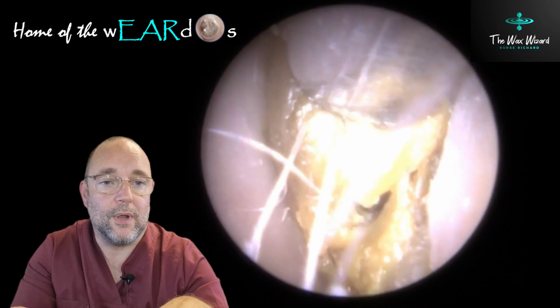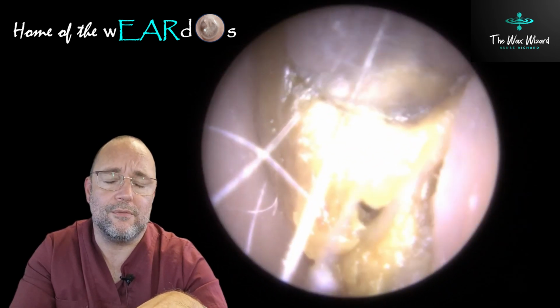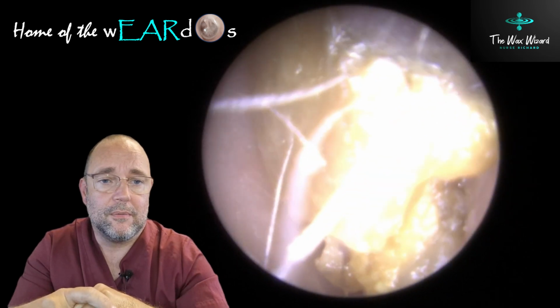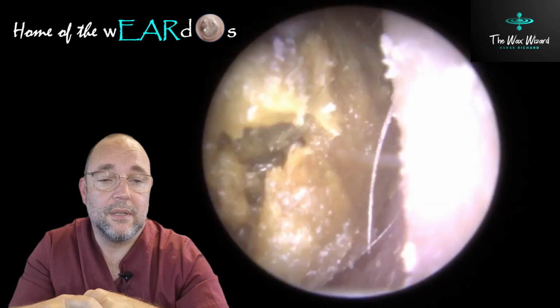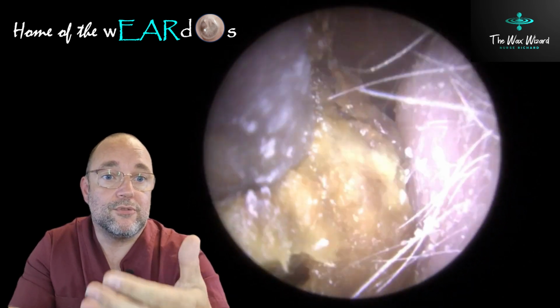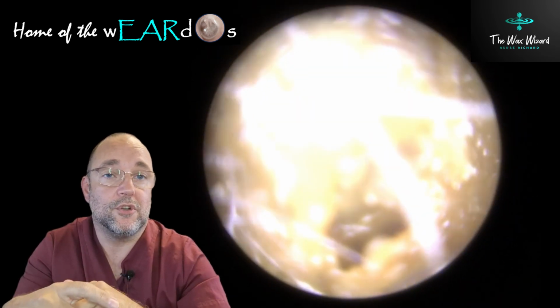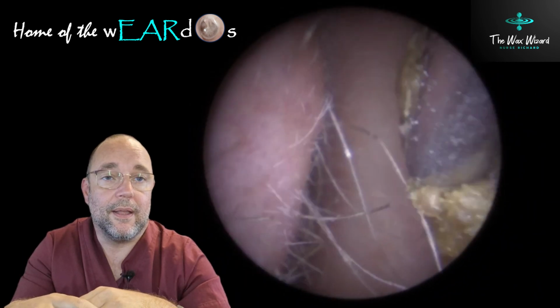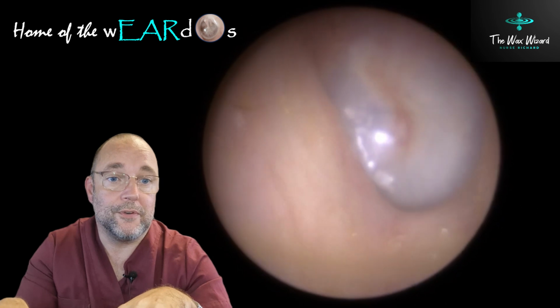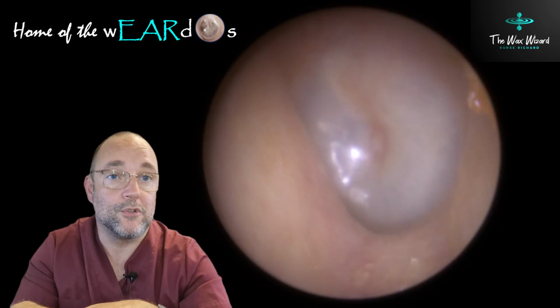But nonetheless, it is quite disconcerting when this happens. It's quite rare, it doesn't happen very often. Maybe two or three times a year I come across it, when you pull these things out and it triggers this cough. Now obviously that comes with its own risks. You've got a couple of sharp implements in somebody's ear and the cough, that's not what you want them to do when you're in there, so you've got to be aware to come out as quickly as you can.